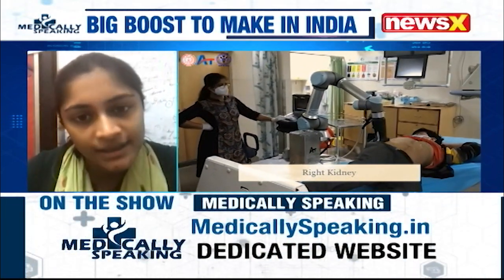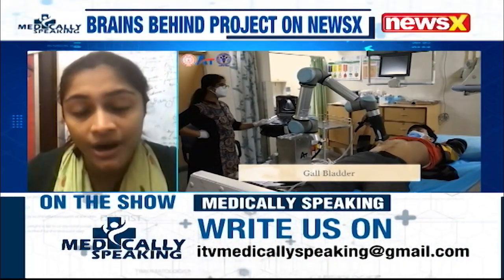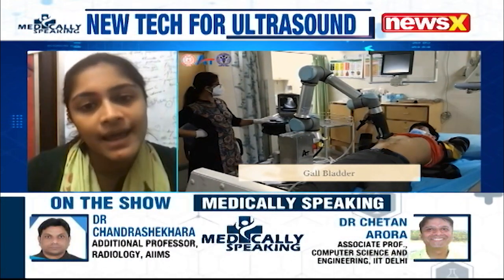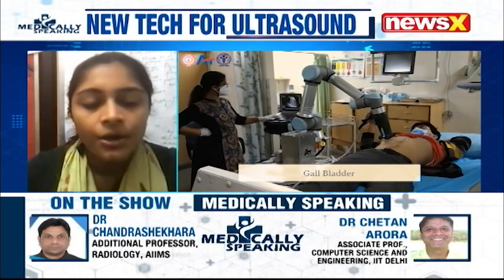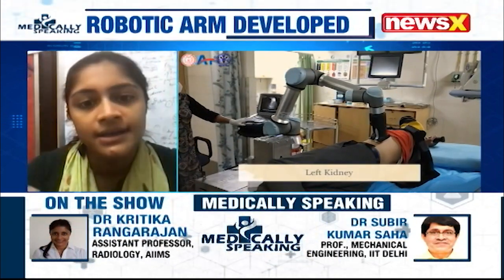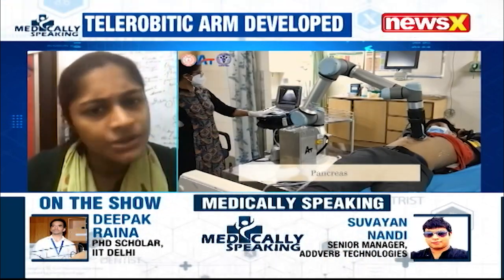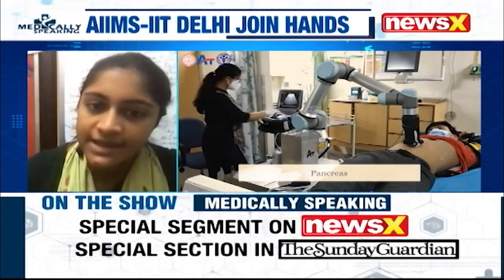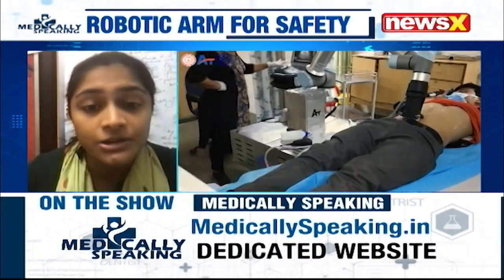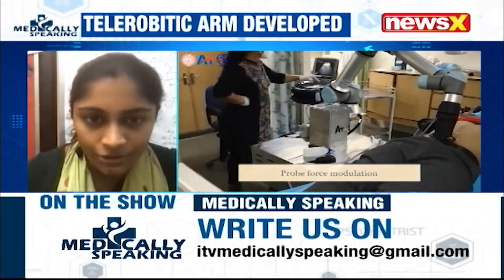So the genesis of the idea actually came from COVID, not only to cut down the operator exposure, but also because inside COVID wards, often ultrasound is required. And usually a trained radiologist has a lot of other things to do. So they're usually in the department, which is usually not inside the COVID ward. There's usually a central radiology department, which has CT scans, and that's where a radiologist is usually positioned because they have CTs, particularly CT chests, to look into.